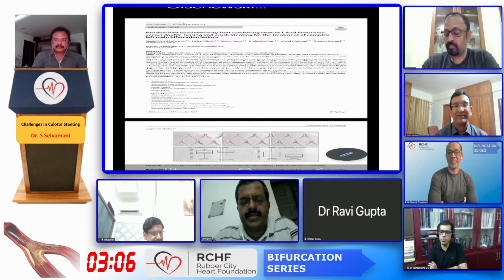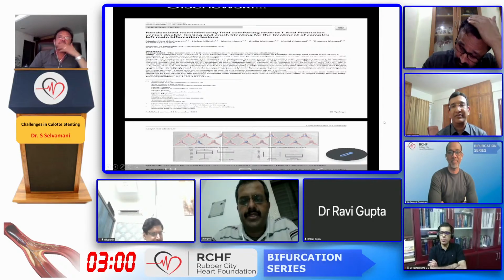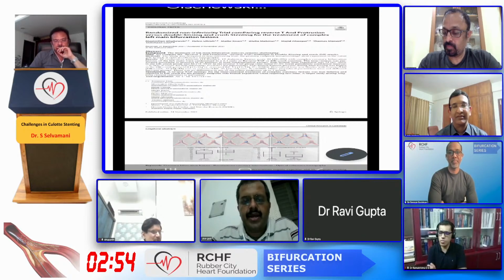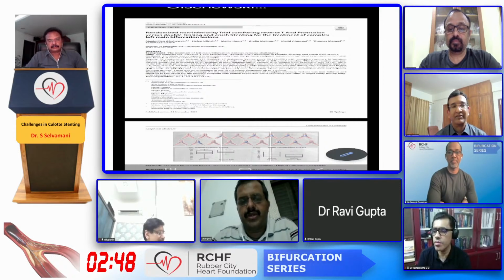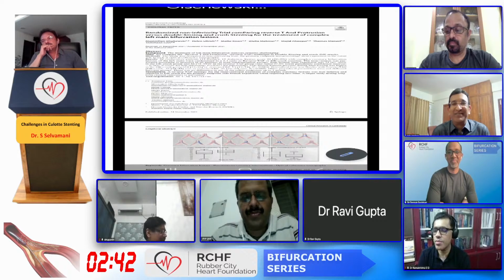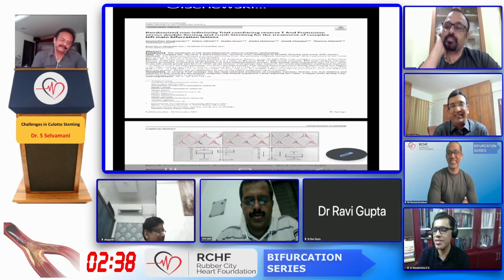Is there any data which says that we need to intervene in all these things? Because pure ostial stenting before imaging was being tried for many years. Every patient doesn't come back actually, even if you have some struts overhanging in LMCA. Like with imaging, we have more and more realized it. But is there any data telling us that we should intervene? No, it's just anecdotal. I mean, when you have many patients coming back, then you try and do something. So no data as such. I don't think anyone would have data.